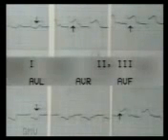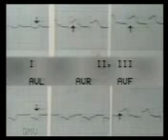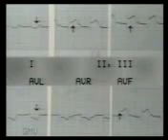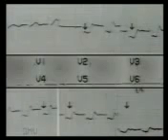In this ECG, note the marked ST elevation in leads 2, 3, and AVF. There is reciprocal ST depression in leads 1 and AVL — this is an inferior wall infarct. The ST elevation with upright tall T waves indicates that it is fresh, less than 1 day old. In the chest leads, there is reciprocal and marked ST depression from V2 to V6. More the number of leads showing ST-T changes, more is the severity of the infarct. So this is a fresh and extensive inferior wall infarct.